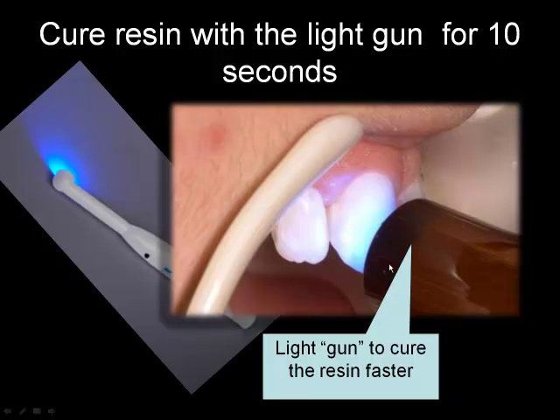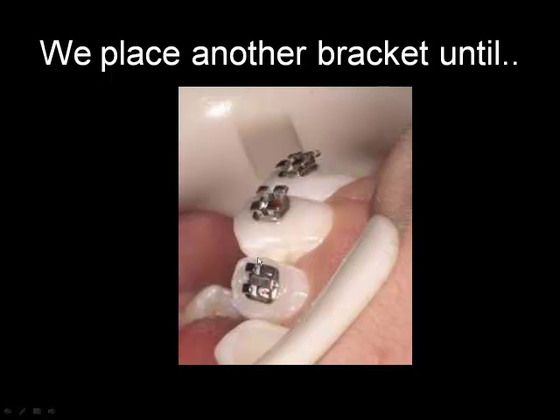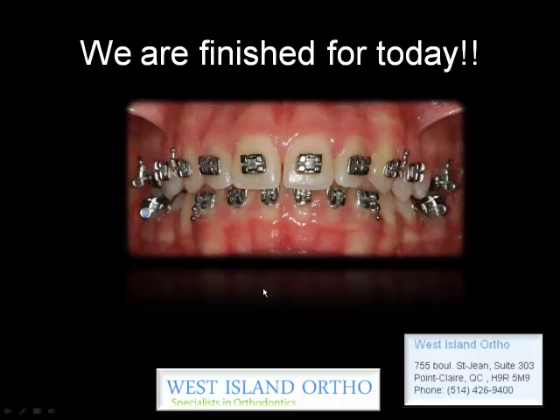Then comes the magic light — lots of patients ask us what it is. It's a very intense light; it's not UV, just very concentrated light. It's blue, applied with a light gun, and we use it to cure the resin. Then we place the brackets, as you can see here, using a mirror to make sure that the brackets are well positioned on your teeth. And then we keep on going — one more bracket — and we're finished.